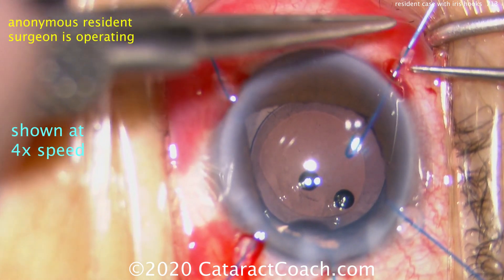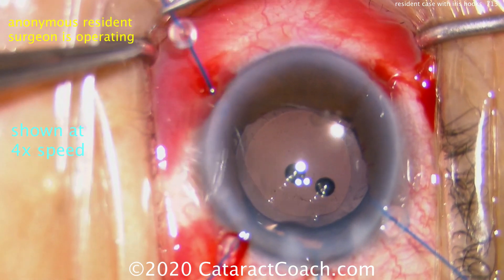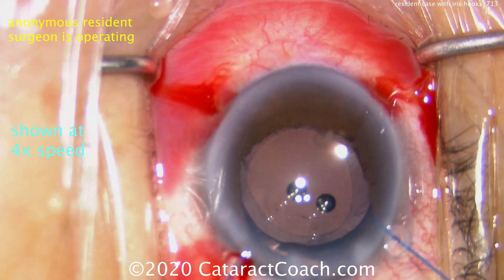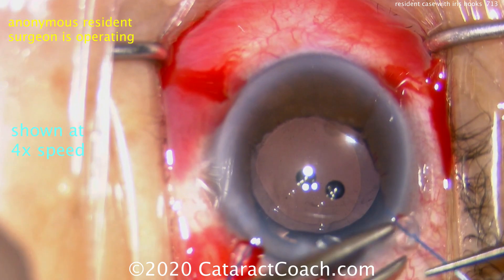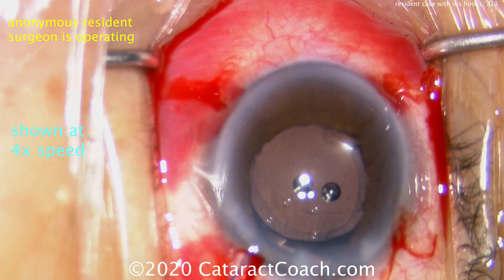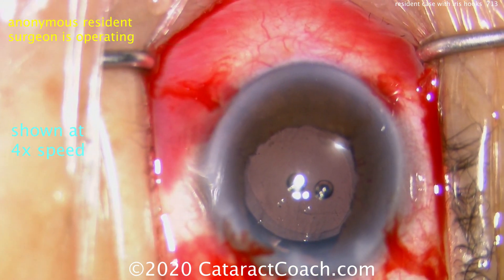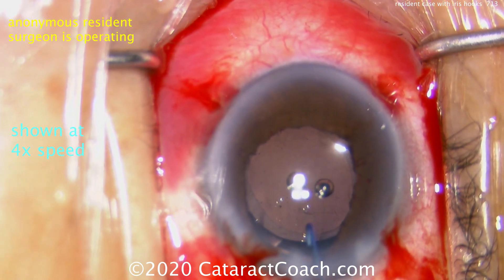So you unhook them. There's a secret shortcut: just grab the iris hook and give it a quick tug. Because the hook is flexible, it'll just release the iris and come right out of the eye. The regular method, which you're seeing here, is pulling the collar back and then unhooking the iris and coming out of the eye slowly.